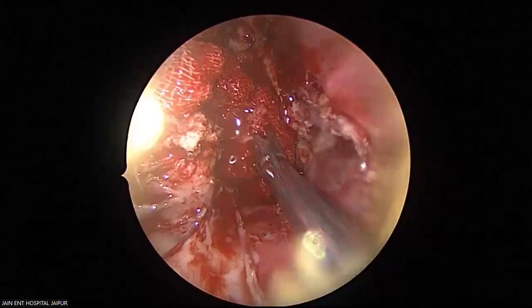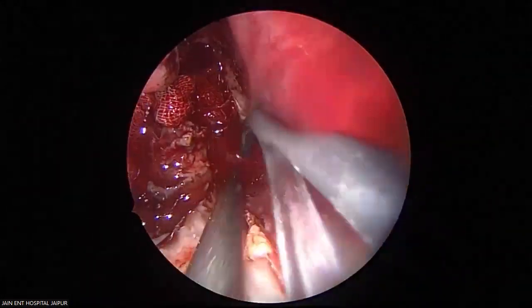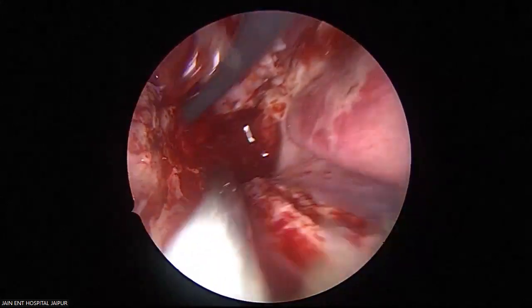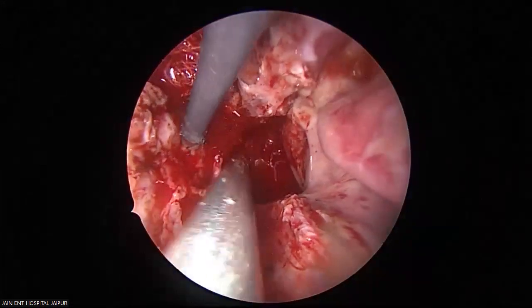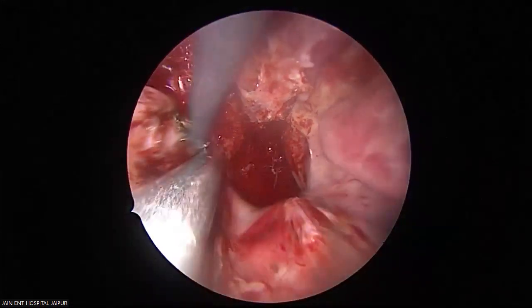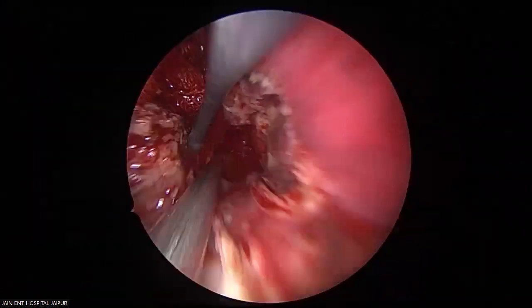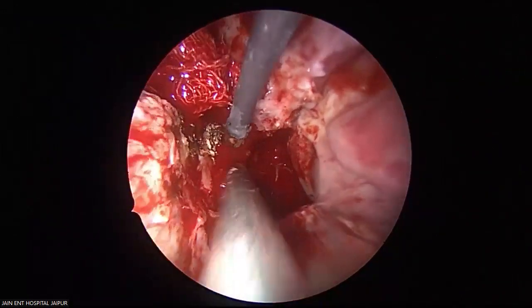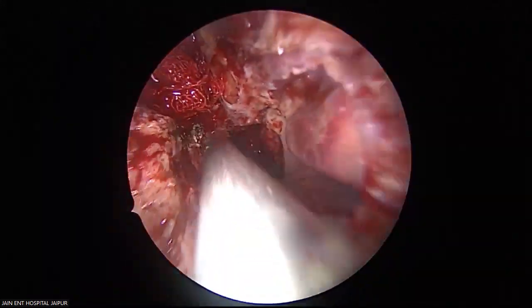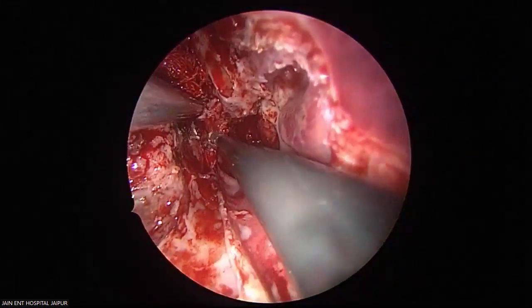This pterygoid bleeding, the bony bleeding, sometimes drilling is required. Yeah, it is always difficult to control, frustrating because it is venous bleeding. See this bone. So what I am trying to do here, I am using my suction cautery over the bone for the time being. See this? Bleeding coming from the bone. Now from this soft tissue can be controlled. See this?